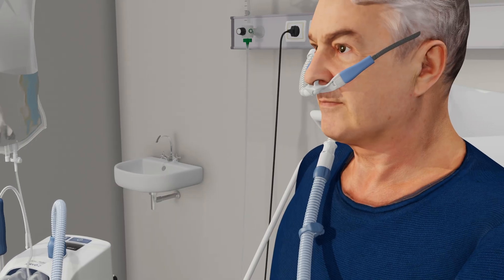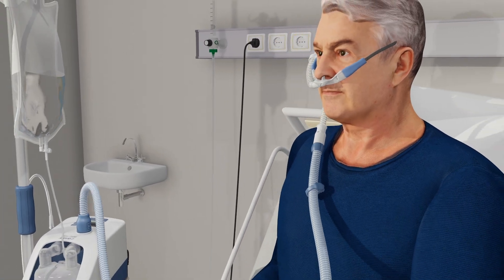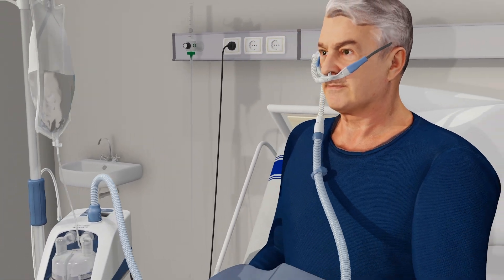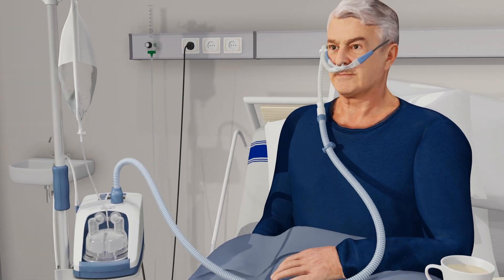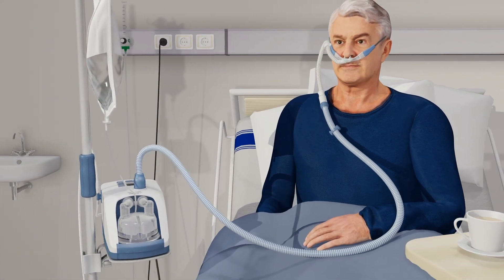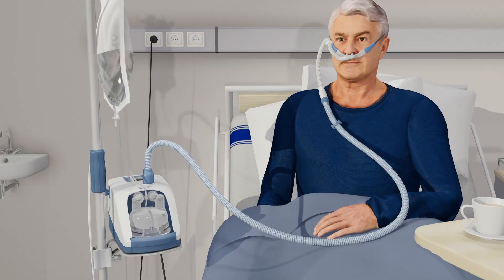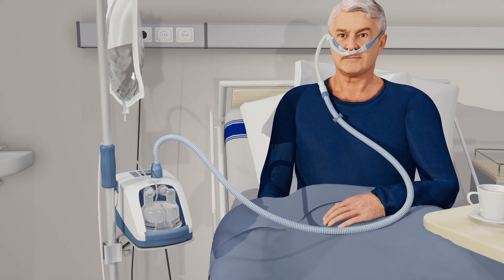The Evo2, together with our OptiFlow range of patient interfaces, provides a versatile and easy-to-use system for delivering humidified high-flow therapy.